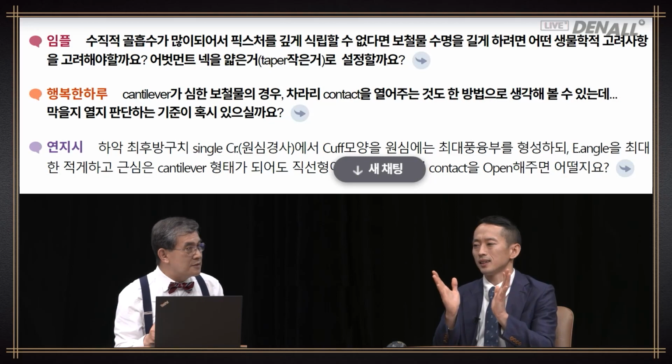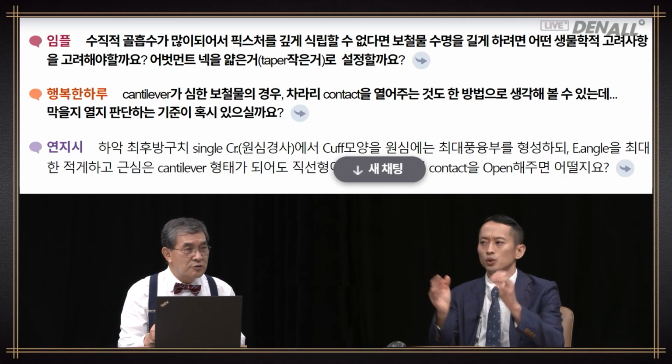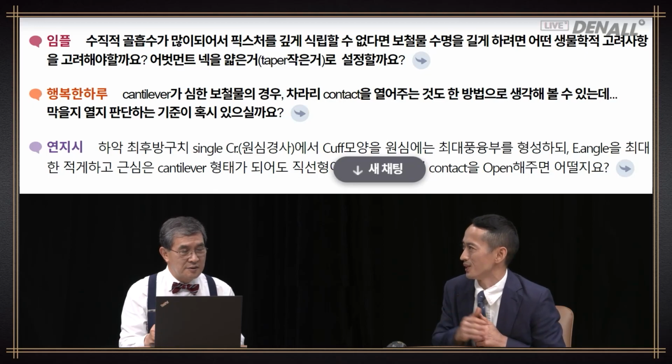Yes, the abutment neck taper needs to be reduced. The occlusal table and contour need to be in line with this. And I agree with you.